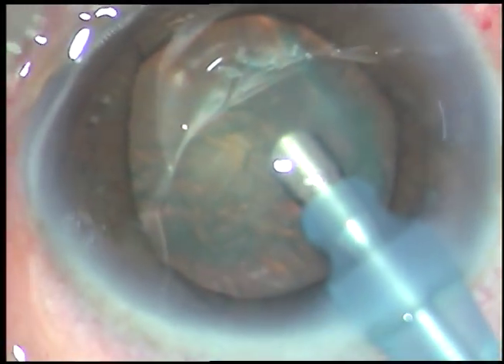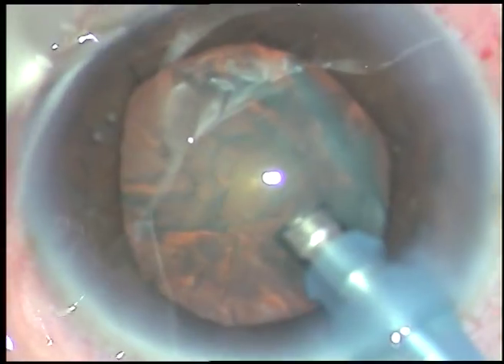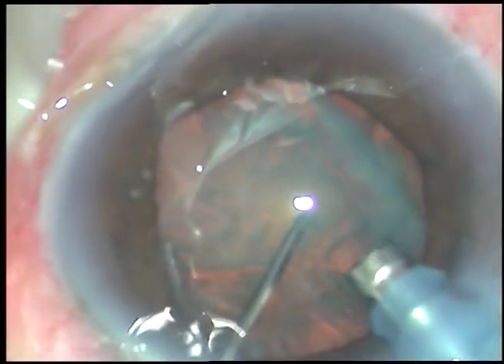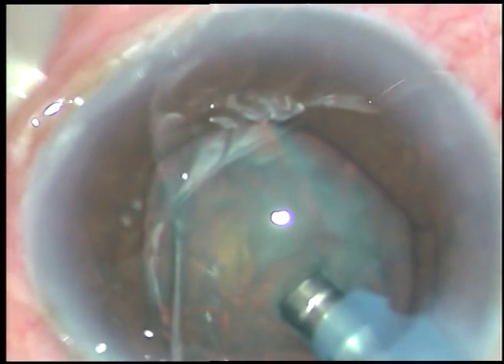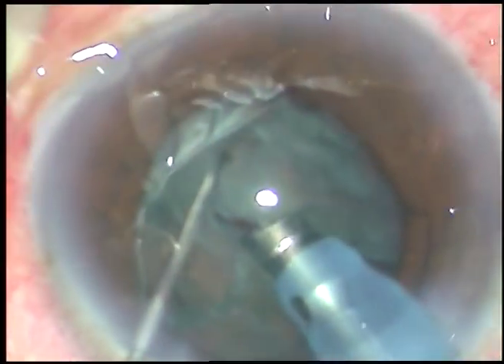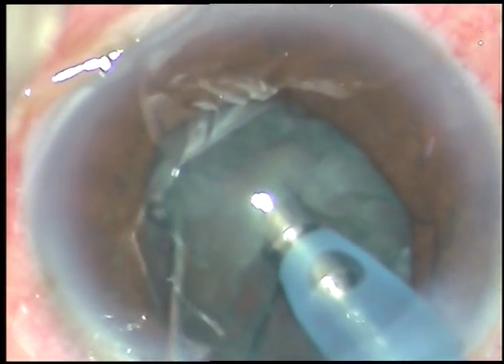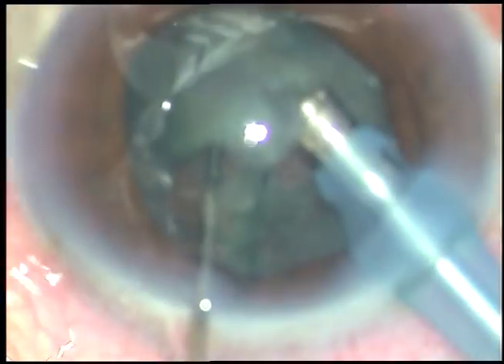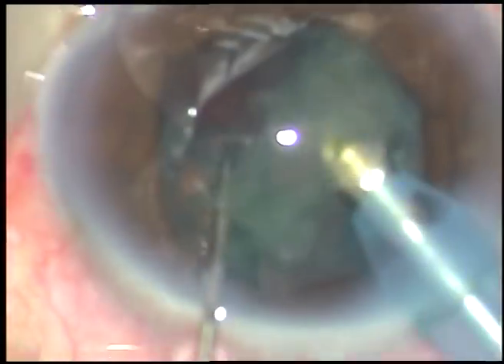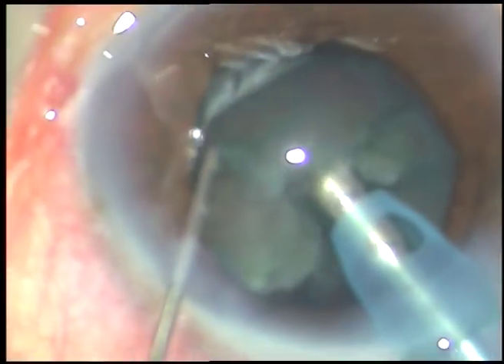Now the lens is being taken out. This is a very early cataract — grade one nuclear sclerosis, very soft. So you just support the nucleus making a pit and slice it with the chopper. This should not be called chopping; this should be called slicing, just to make a distinction. Make a small pit, support the nucleus keeping the tip of the phaco handpiece in that pit, and bring the chopper from the periphery to the tip. Thus you can do slicing or mechanical chop.